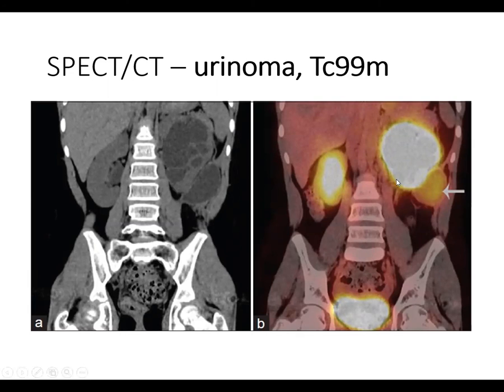And on this slide we can see the overlap over the computed tomography image of the nuclear scan, which was performed on the hybrid device simultaneously with CT, and we can see an increased accumulation of radiopharmaceutical in this region outside the kidney, which allows us differential diagnostics of the lesion.